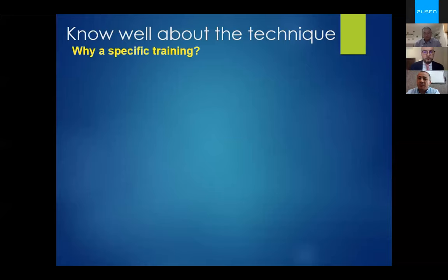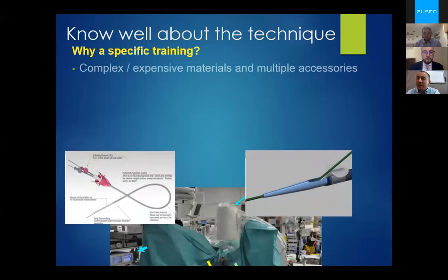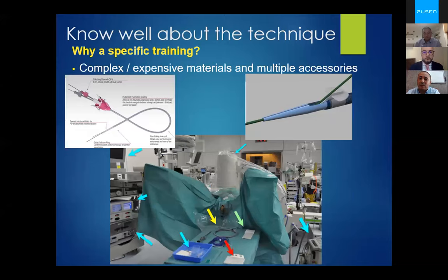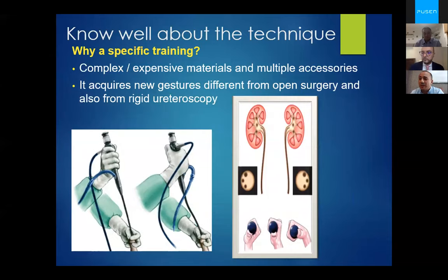Because first, it needs complex and expensive materials and multiple accessories, like we see in these pictures. Second, it requires new gestures different from open surgery and also from rigid ureteroscopy. The surgeon must do permanent mental work to be well oriented in space in three dimensions. He has only three movements to do this: turn to the right or left, ventral and dorsal deflection, and move forward and backward. Only three movements in three dimensions.